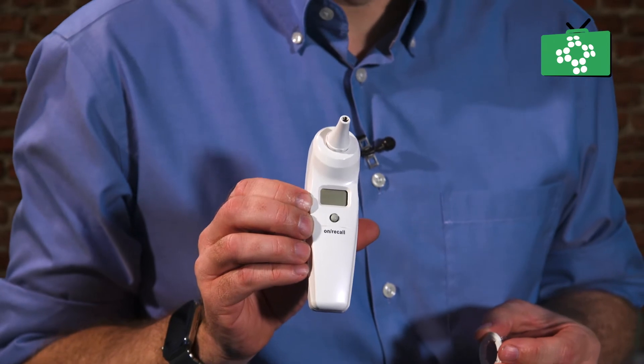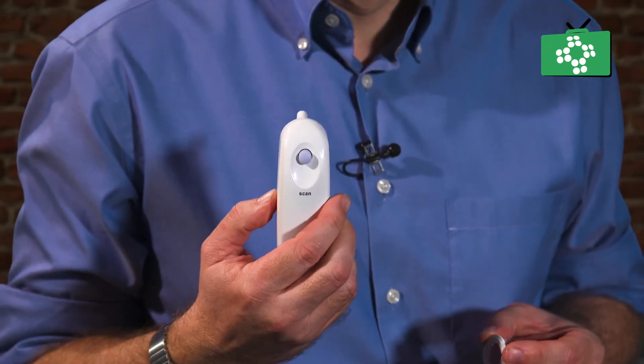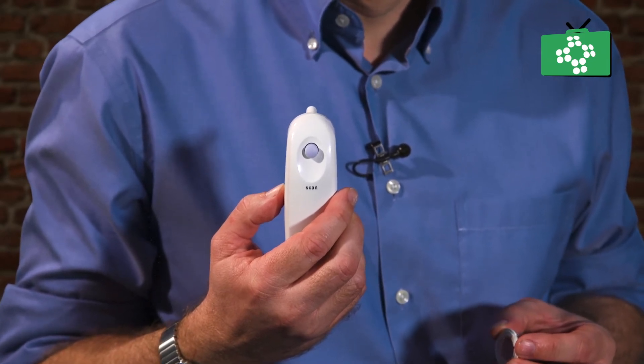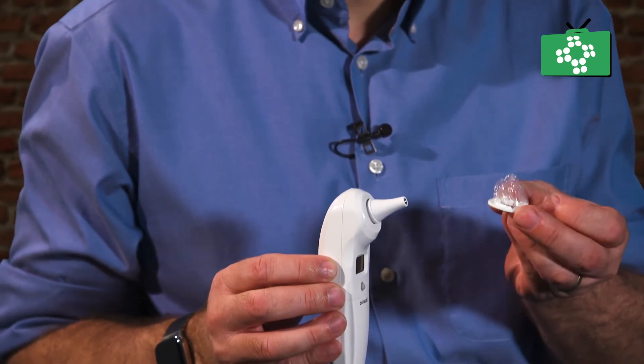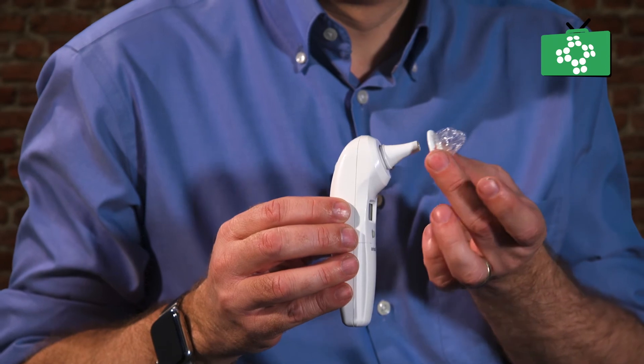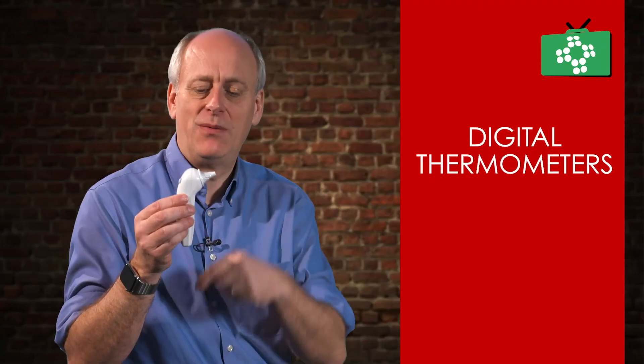This is inserted into the ear, but the important thing is you don't ever just put it straight into the ear, because the actual probe can be a very high level of infection risk. So you would always use a cover. Different models have different types of cover — this one is a very thin plastic cover. You just pop that on and twist it around, usually just half a turn, and the cover is now on.